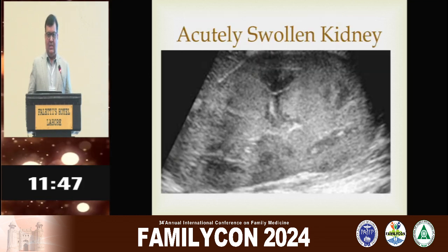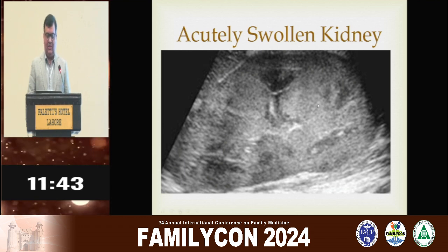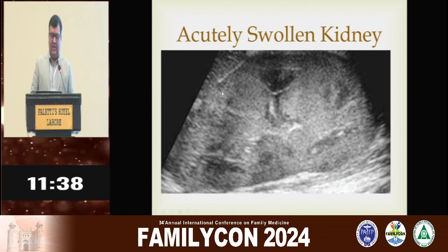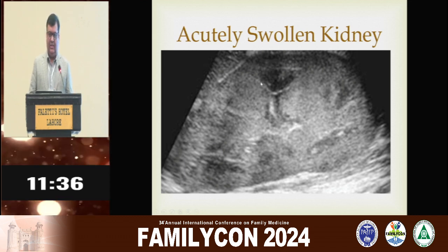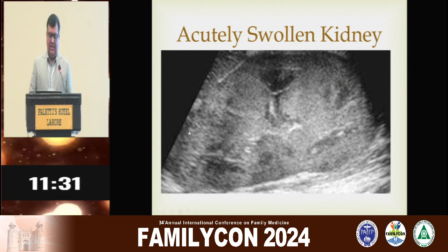Then there are certain conditions where the kidney is swollen. You can measure the size of the kidney, and it's usually larger than normal by a couple of centimeters. And if you look even here, the corticomedullary differentiation is gone, but the kidney is swollen.